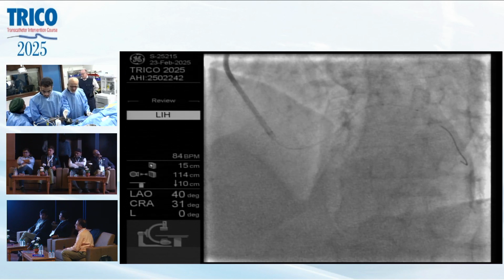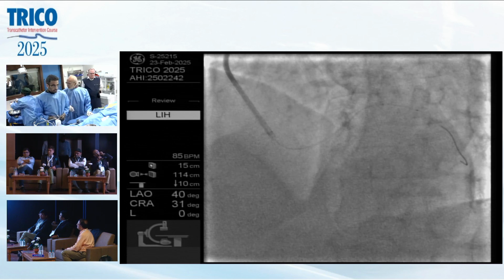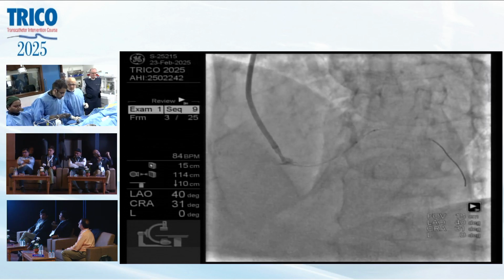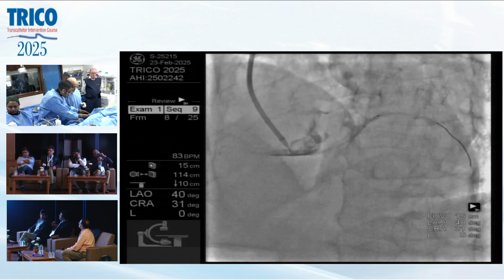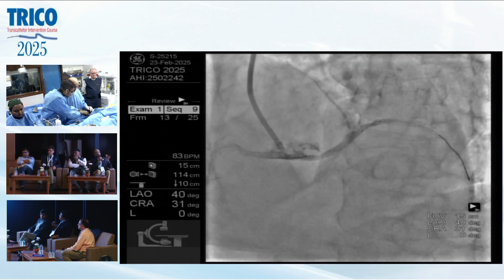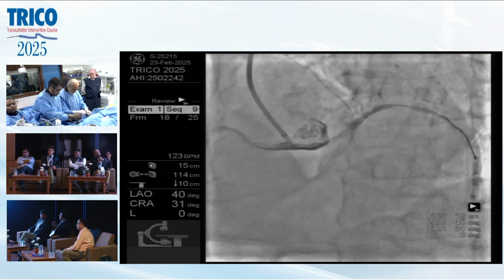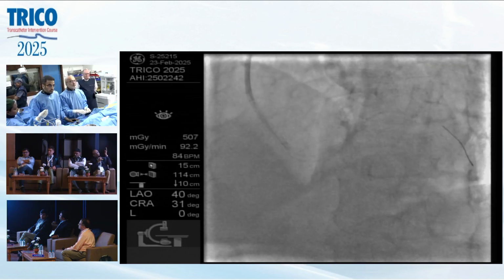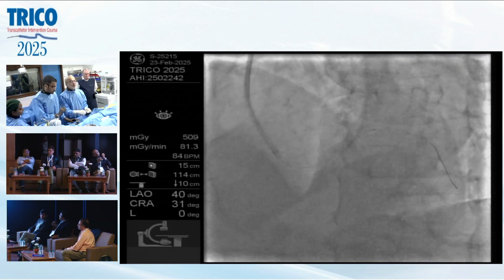Yeah, as I told before, the short Amplatz 0.75 would be the first choice. It may directly even look into that, and it will give a lot of support sitting in the sinus. And I will go with any over-the-wire that should have crossed this lesion. The lesion is very distal, so it may need support.